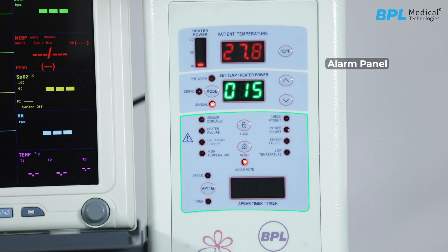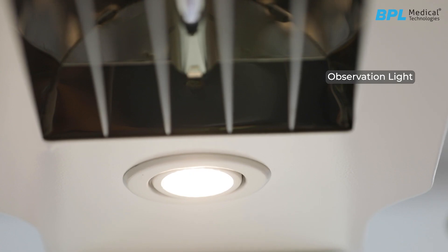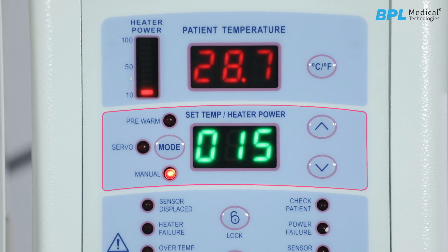The alarm panel is present along with an Apgar timer and countdown timer. There is an observation light switch, an on/off button, and a power on/off button. The Floret warmer has three modes: pre-warm mode, servo mode, and manual mode.